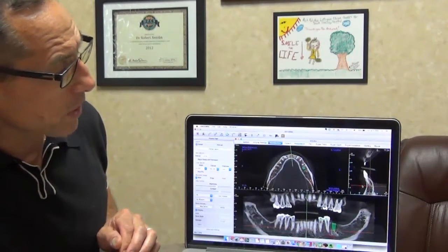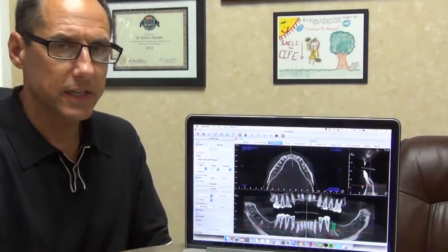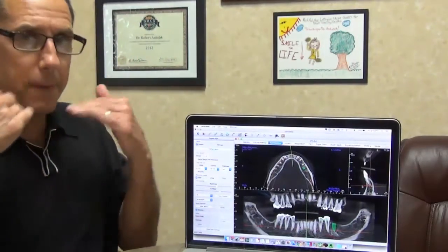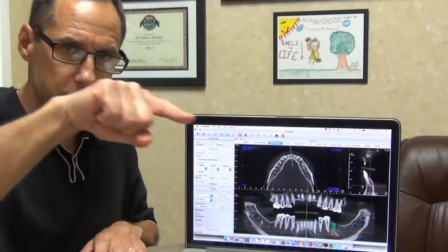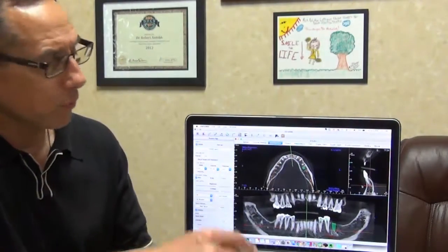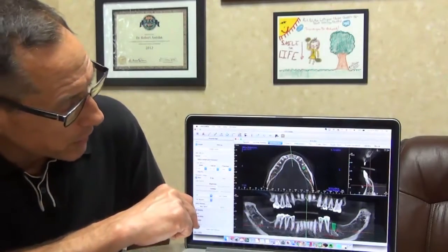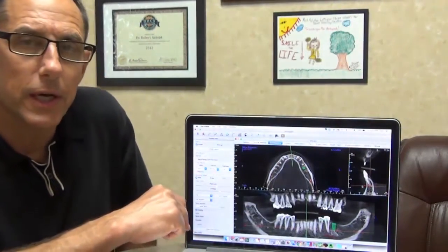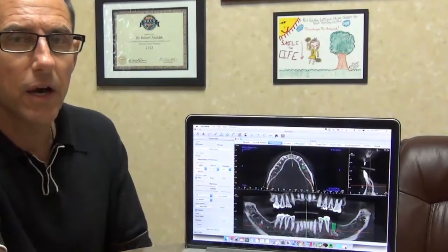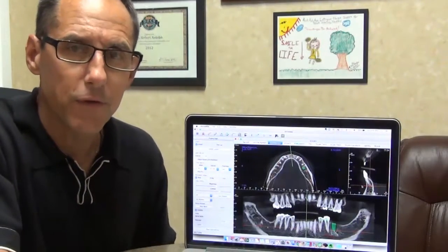With this type of software, we're able to send information so we can create what we call surgical guides, which are little devices that snap over the teeth and allow us to be very accurate with the placement of the little holes where the implant would normally fit and function. This is the type of technology that is necessary, especially when diagnosing and treatment planning for implants.